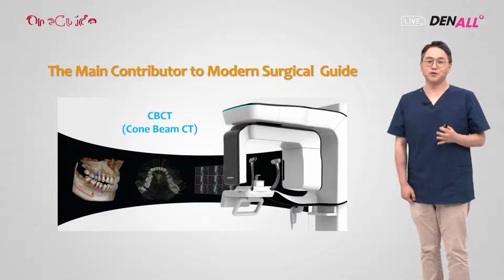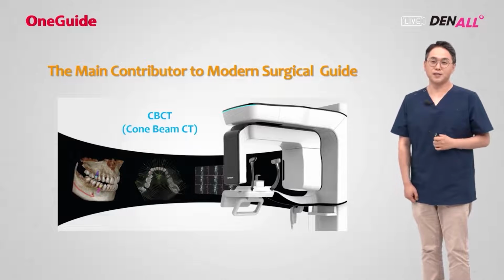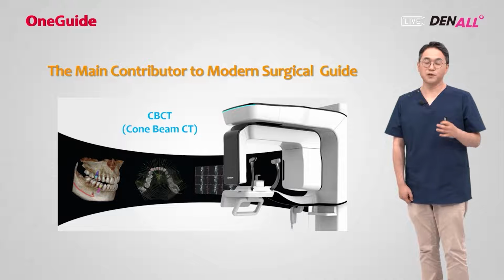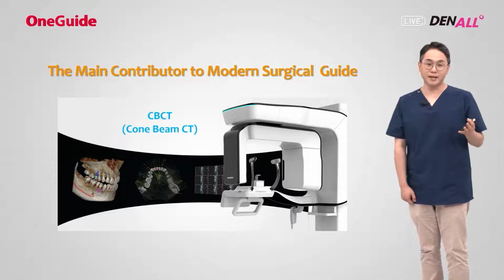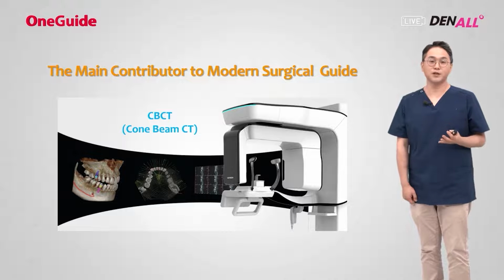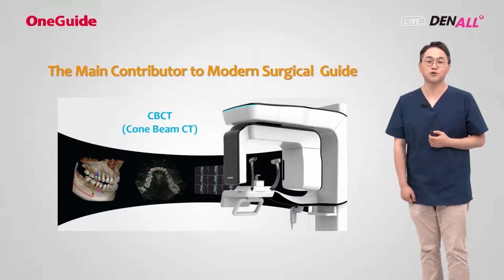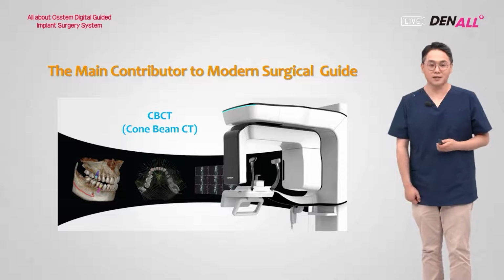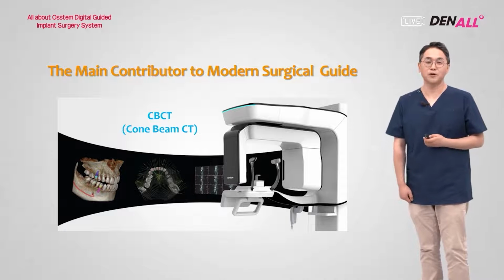Digital guide surgery has become popular because of CBCT. Cone-beam CT is widely used, and you can see teeth, bone, anatomic structures, the mandibular canal, or sinus floor. You get accurate information of anatomical structure. And this has made guide surgery possible. Without CT, digital guide surgery might have been difficult.